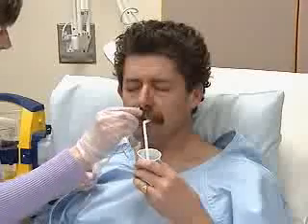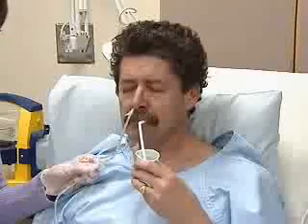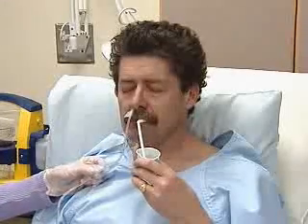Advance to the measured mark and anchor the tube to the cheek while you make sure the tube is properly positioned. Your patient should be able to speak.